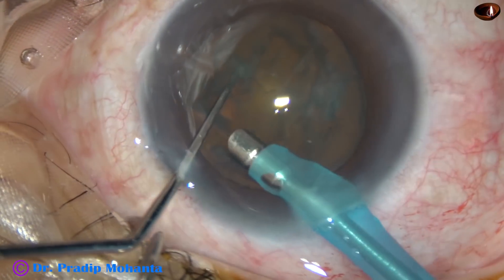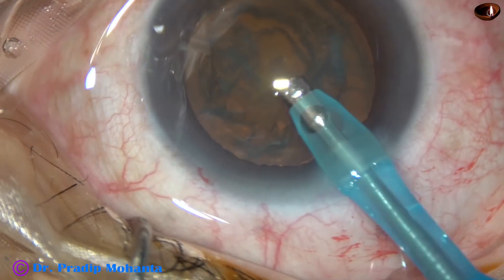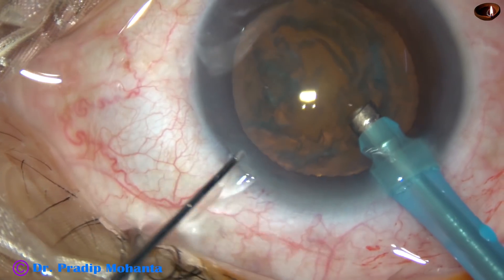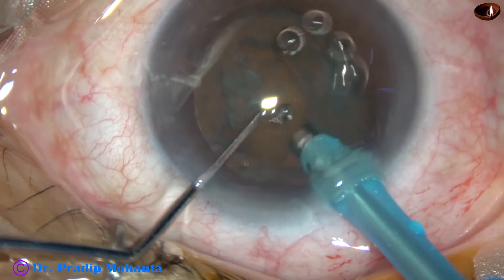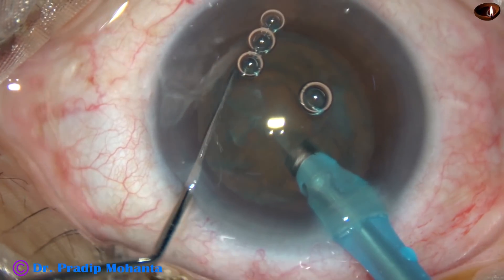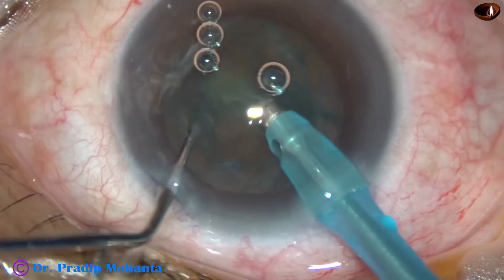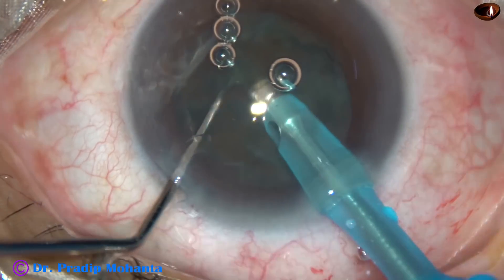Some superficial cortical lens matter is removed. In bevel-down position, the handpiece is turned, bevel is up. Now the tip is buried and it is just kept there in irrigation. And the chopper slices the nucleus.